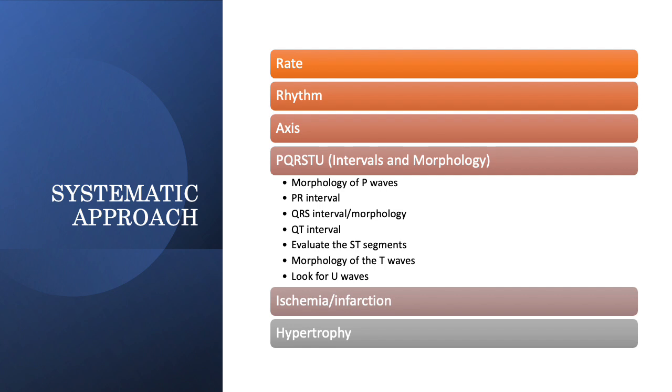In this part two, we're going to talk about rhythm analysis. Rhythm analysis is typically the most difficult portion of interpreting a 12-lead EKG. And so we're going to spend a significant amount of time talking about rhythm analysis in this session.